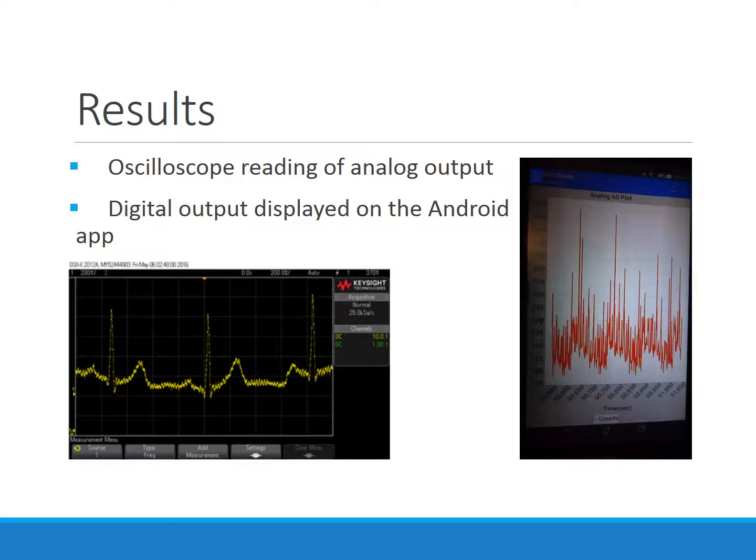As you can see, there is the local maxima, which indicates the QRS complex, as well as the P wave, which can be seen as the slightly smaller maxima beside the obvious maxima. Although there is a bit of noise, you can clearly see the sinus rhythm within that noise.